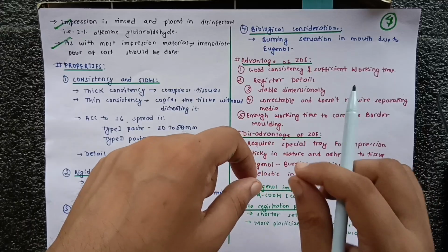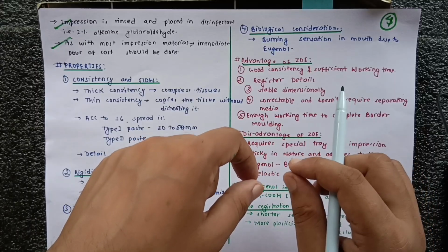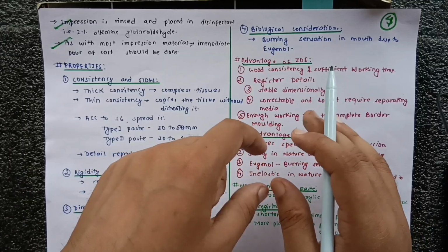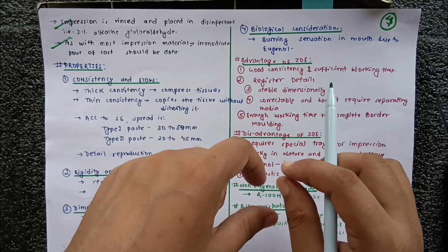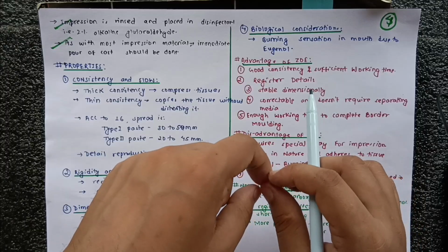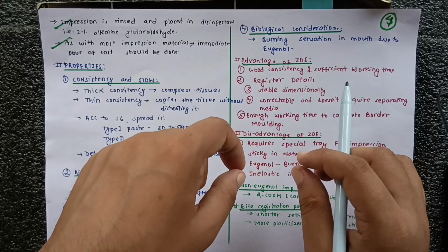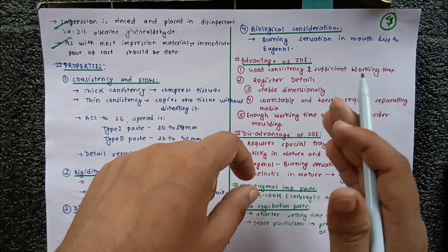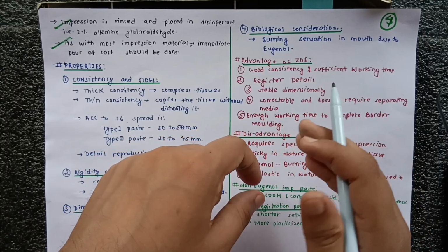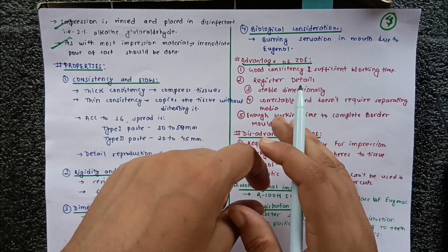I am stressing this point. You should remember this, and this is very important, and you can't afford disturbing the quantity during the dispensation. You should dispense the proper length and the proper diameter of the paste on the glass slab of both base and the accelerator. The color of the base is white and the accelerator is red. I have discussed this previously.